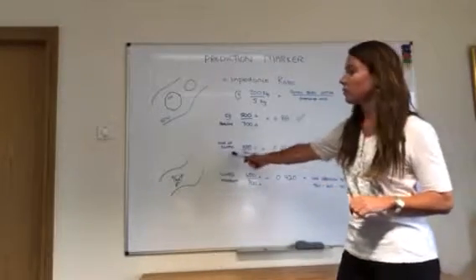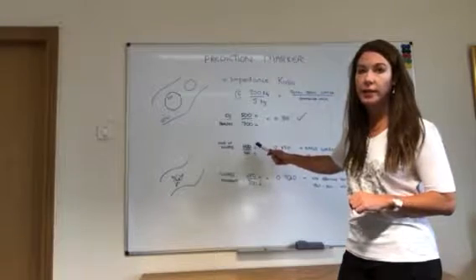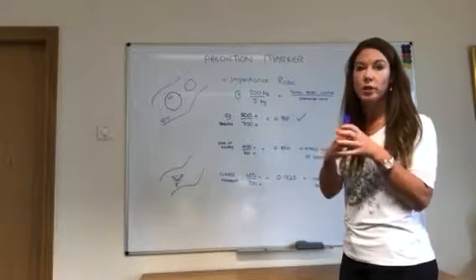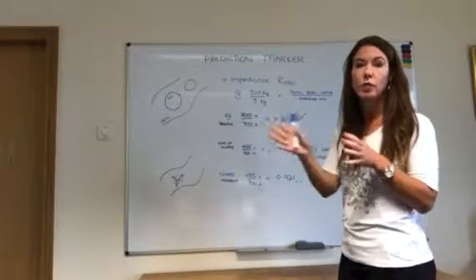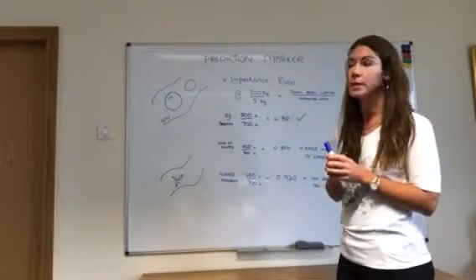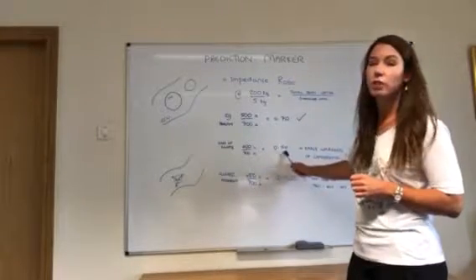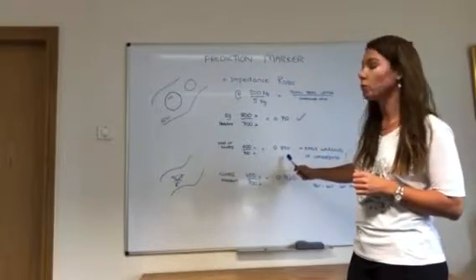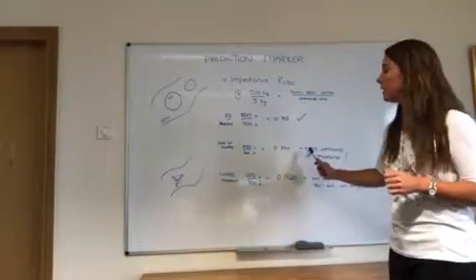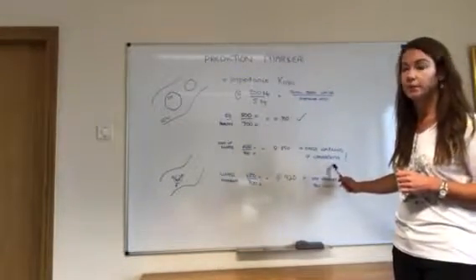So at the start of illness, when that impedance value is much higher than what it should be, it means that the cell is unable to hold on to that intracellular water and fluid is excreting out into the extracellular fluid space. Just to show you the figures, that will give you a ratio of a much higher value, closer to 1. So 0.85 for that person. That means it's an early warning sign of lymphedema.